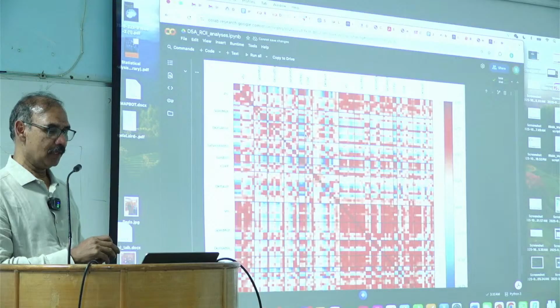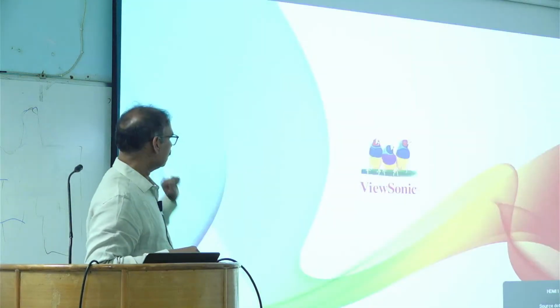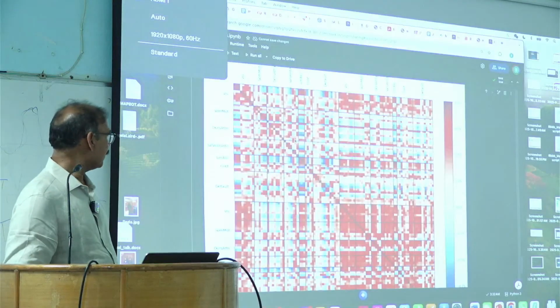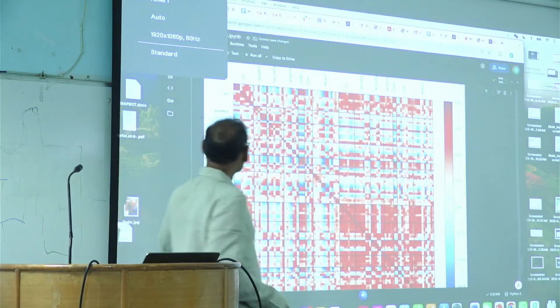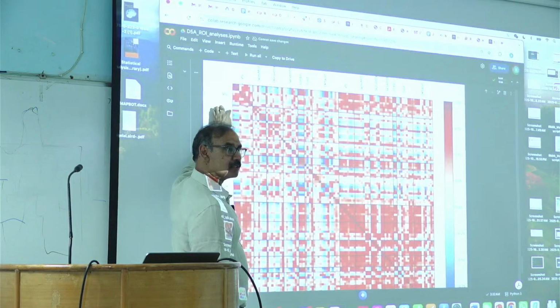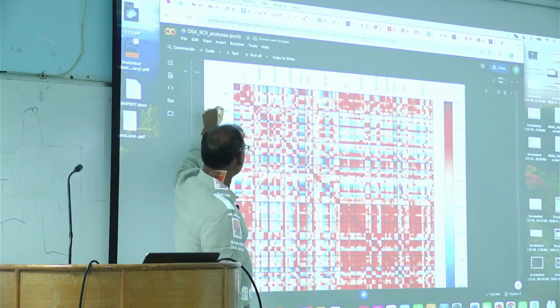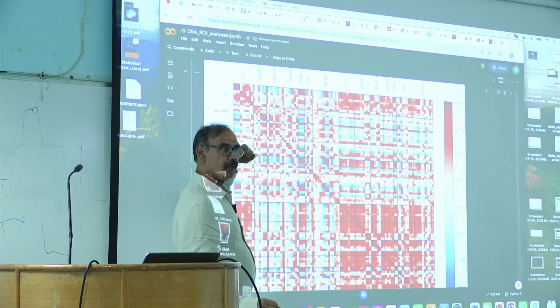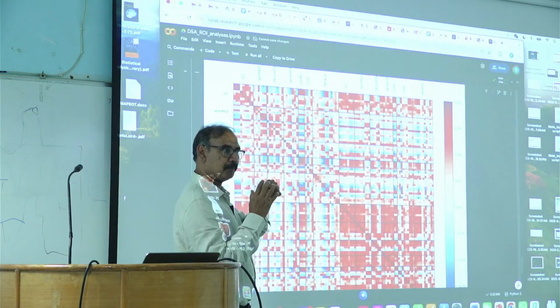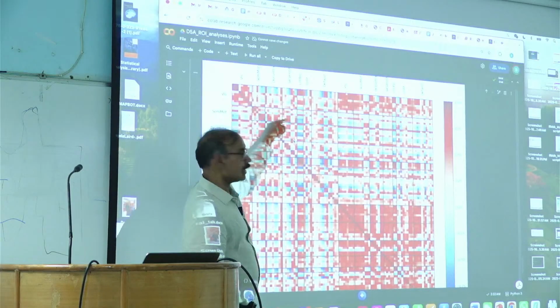Very good. So in this case, there are several regions from the seed based. And as Rahul said, if we were to take a voxel from the left motor cortex, then it would be this line.